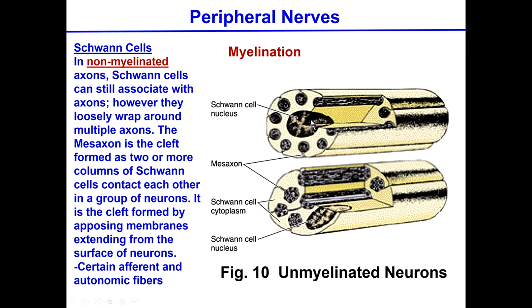This is a section of one of these non-myelinated nerves, you can see the axons, all these axons are actually protected by what seems to be one single Schwann cell that is kind of making holes to protect them. And in making those holes, there are these points of junction that create these kind of little breaks in the membrane of the Schwann cell, and this is what is called the mesaxon structures. So there are Schwann cells protecting, but they do not form the myelin.